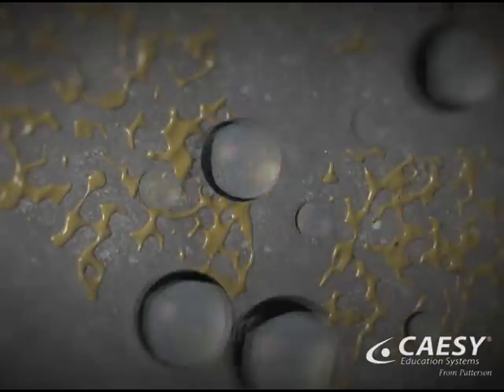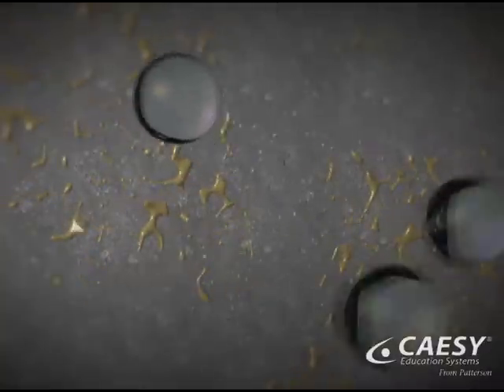These vibrations also cause millions of microscopic bubbles to form in the water. When these bubbles collapse, the energy that's released helps to gently dislodge harmful bacteria.